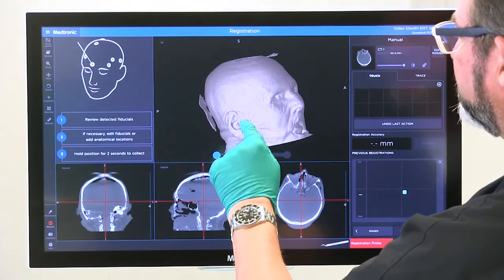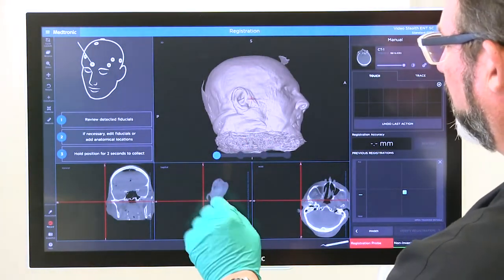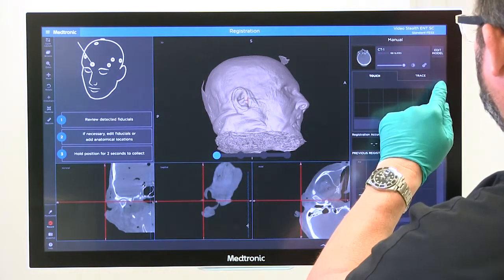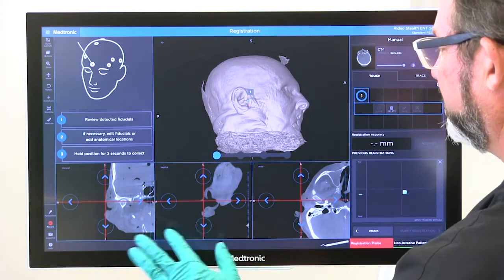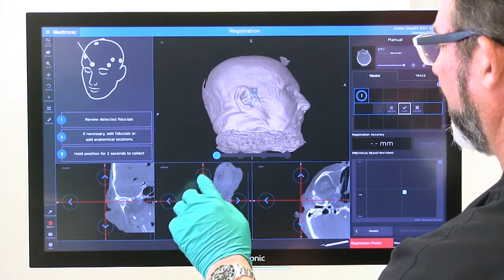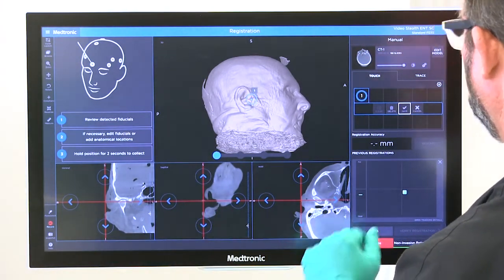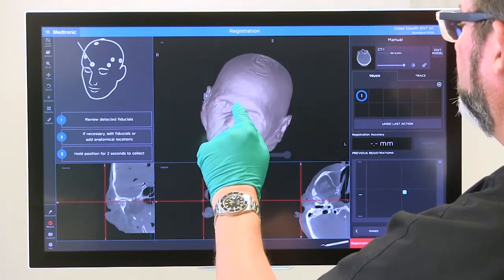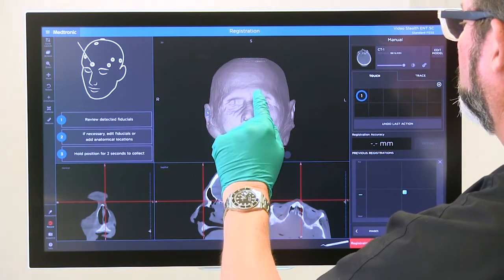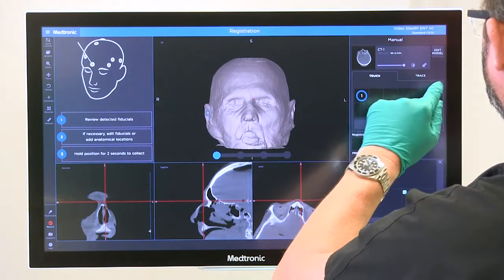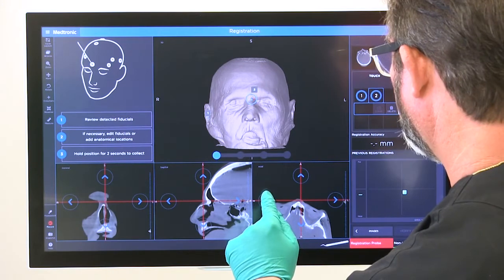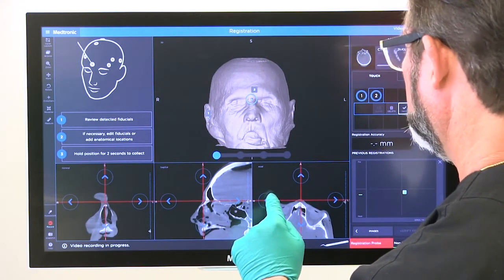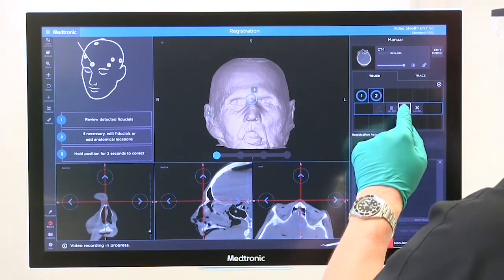To select those, we'll just take our finger and find our tragus. Then you're going to touch the plus sign, and you'll see these little windows show up where you can actually refine your point and then hit save. We're going to touch our next point, hit plus, refine that as well, and then hit save.